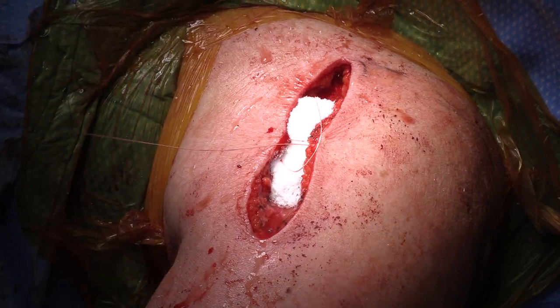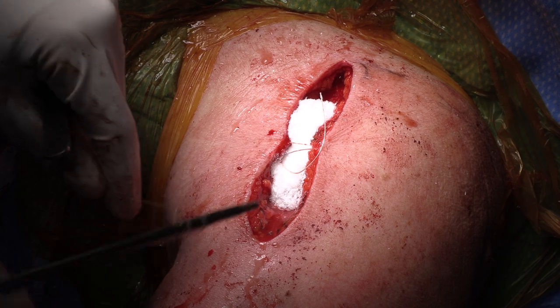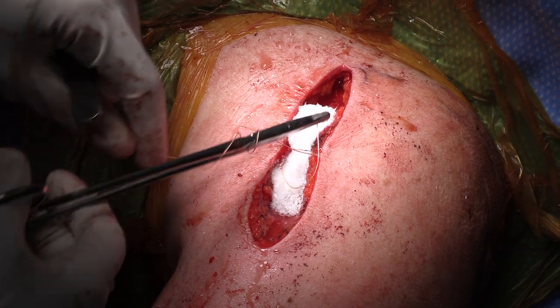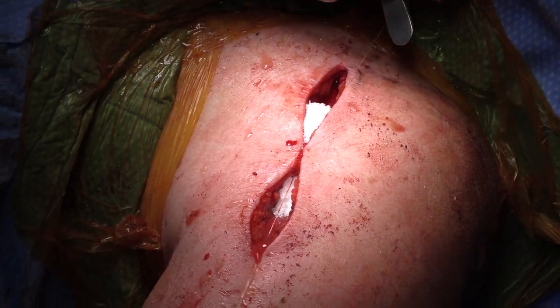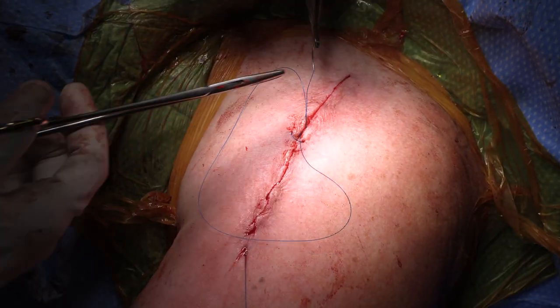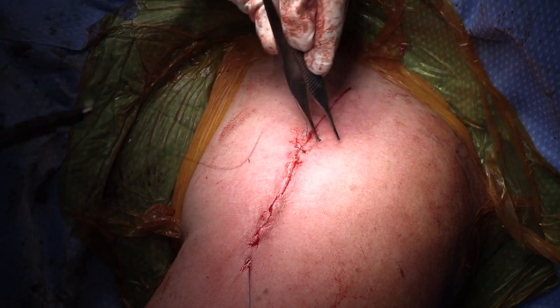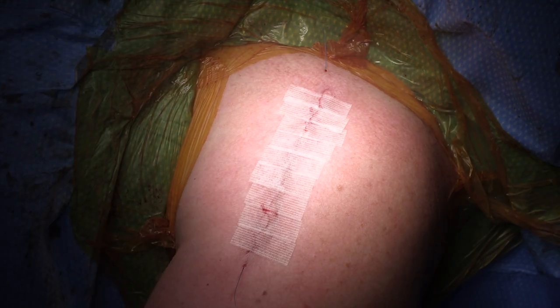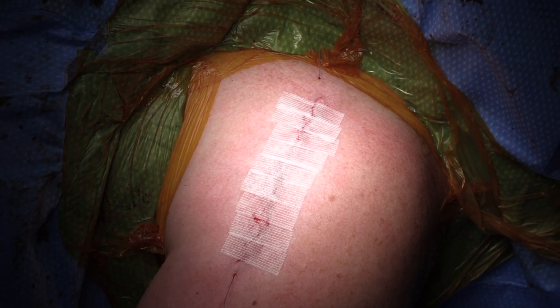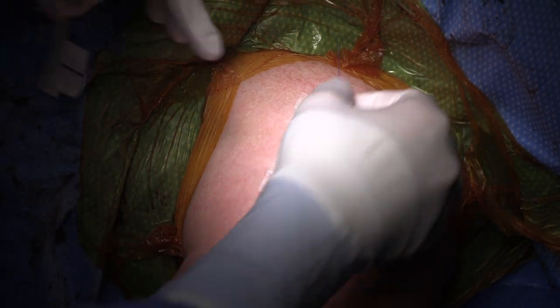The subcutaneous tissue is closed with simple interrupted absorbable 2-0 sutures. The skin is closed with a running subcuticular closure with number 3-0 nylon suture. Steri-strips are applied, followed by a sterile dressing.